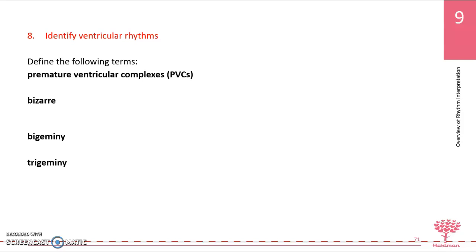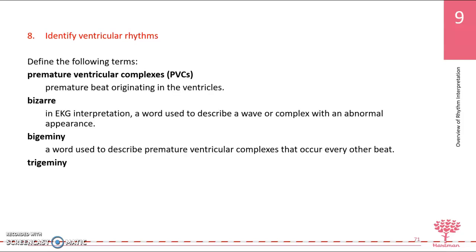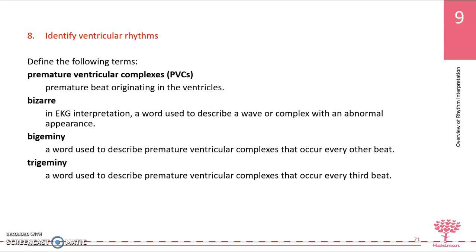Ventricular rhythms are the other part that we're going to talk about today. Again, I'm just going to go through some high points and some things to remember about ventricular rhythms, but you really need to go through and review it yourself as well. You also have those flashcards for these. Those practices that I've been giving you, we're going to continue to do those too, so make sure that you're taking those seriously and focusing on those so you can understand and be able to identify these different rhythms.